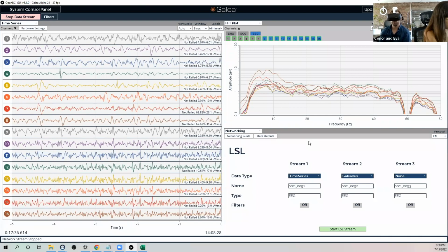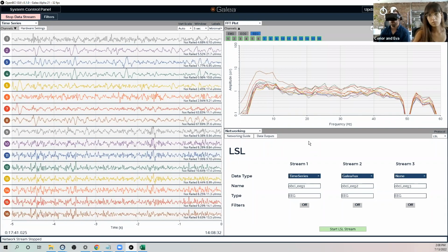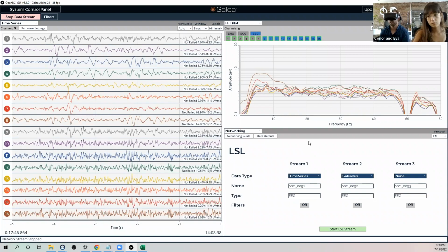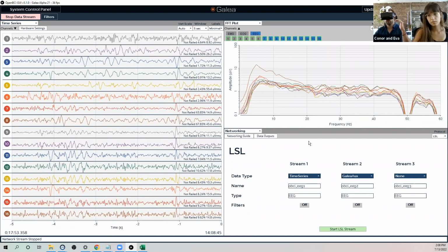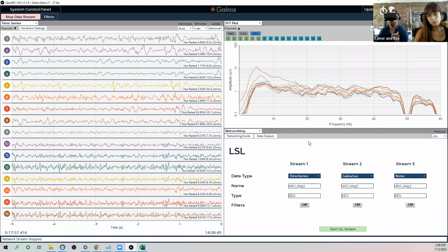But then the idea is that over time we would continue to refine those models to make them better, based on donations of data from beta customers and our partners and collaborators. So that is kind of like, if you don't want to deal with the squiggly lines dancing around on the screen and decoding your own data, you can work with that, or you will be able to work with that.